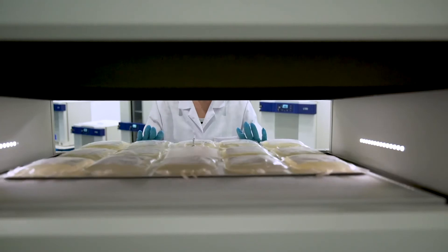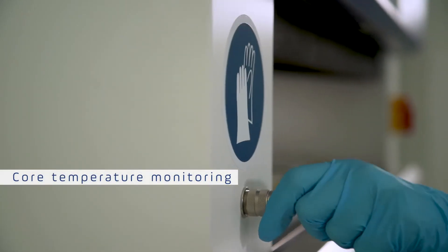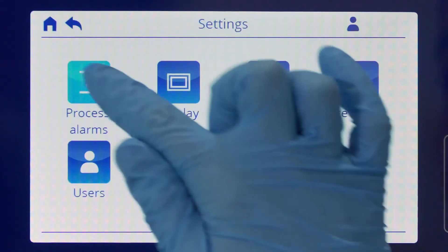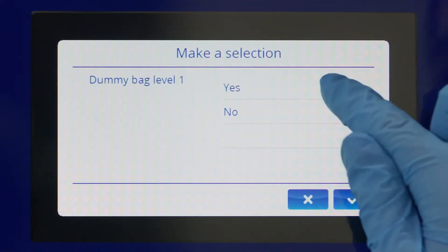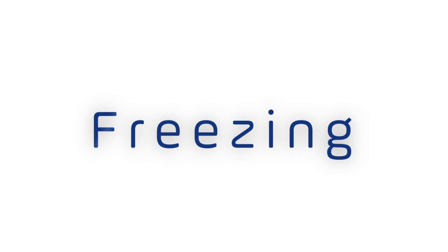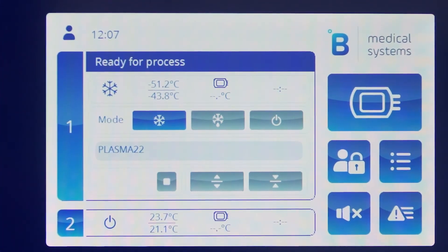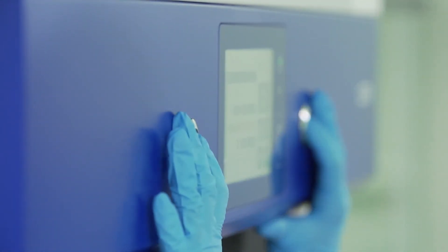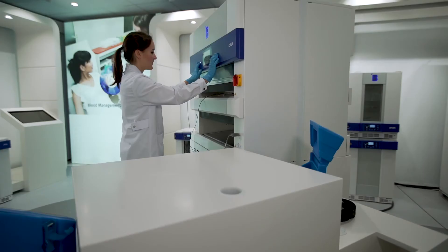If you want to monitor the temperature of your bags during freezing, don't forget to connect the dummy bag. You are now all set to start the freezing cycle. Close the plate by pressing the button simultaneously. The freezing will start automatically when an optimised pressure is applied on your bags.